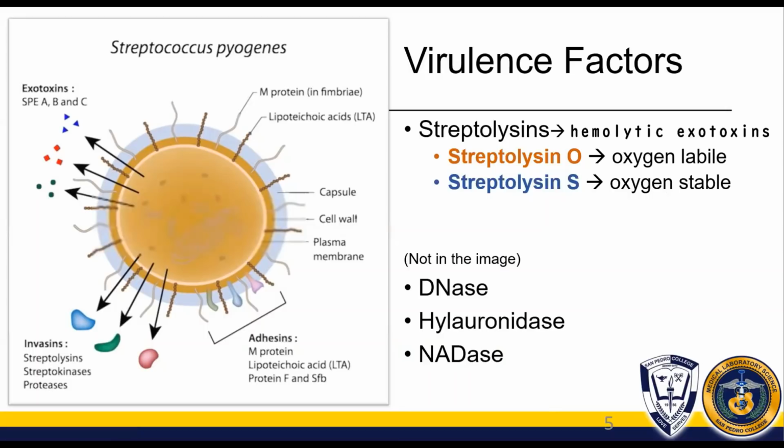When we say antigenic, they are able to bind to the antibodies which the antigens are directed to. For example, the antigen streptolysin O will bind to its corresponding antibody, which is anti-streptolysin O. So, streptolysin O antigen will bind with anti-streptolysin O antibody. DNases, for example, will bind with anti-DNase antibodies. So that is how our streptococcal antigens work. The antigens, in the presence of the corresponding antibody, will bind together.